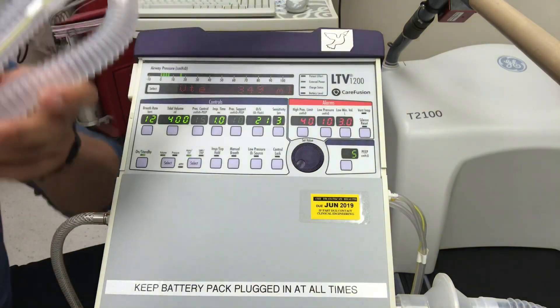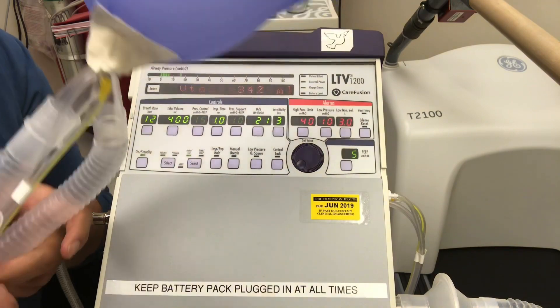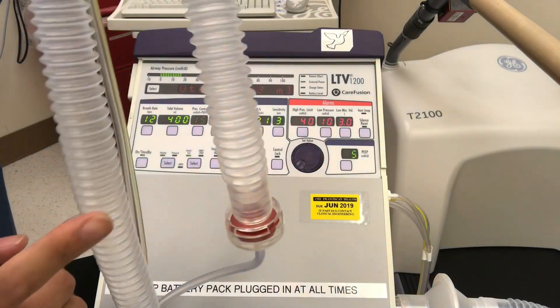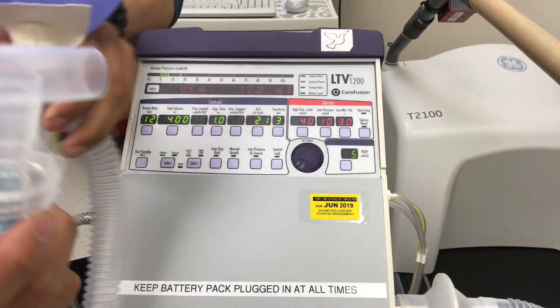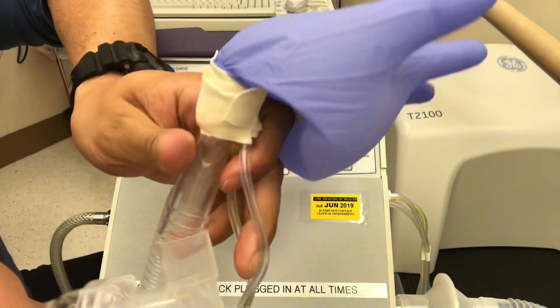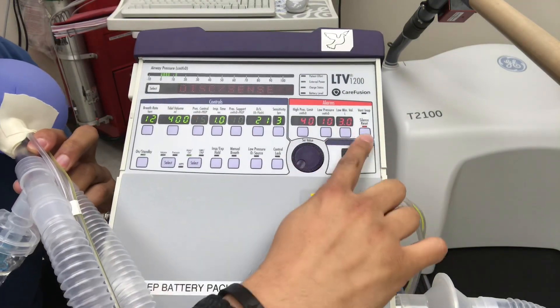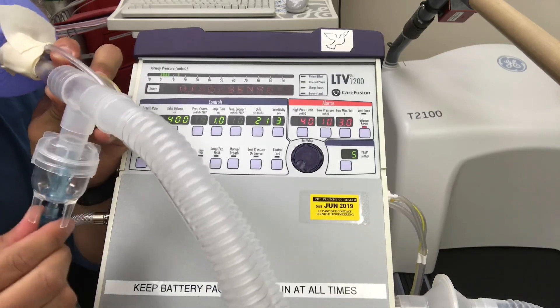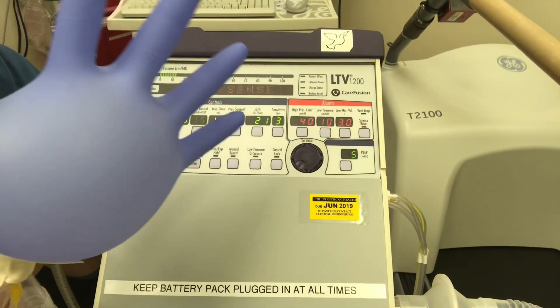We can also show how to set up the inline nebulizer. Make sure you put it on the correct limb — the inspiratory limb, not the expiratory limb. Find the inspiratory limb, then take your nebulizer with a T-piece and tee it in right there. Connect the gas source and pipe that in, and now you have your treatment going alongside the ventilator.